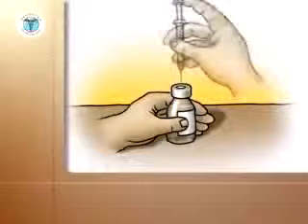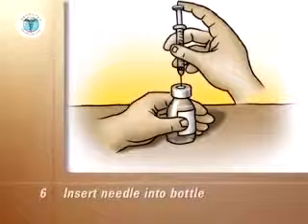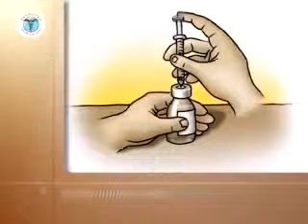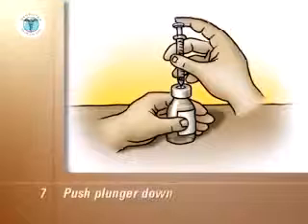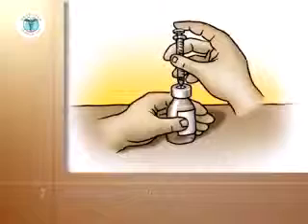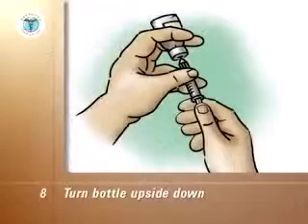With the insulin bottle held firmly on a counter or tabletop, insert the needle through the rubber cap into the bottle. Push the plunger down so that the air goes from the syringe into the bottle. Turn the bottle upside down so that the air in it is at the top.